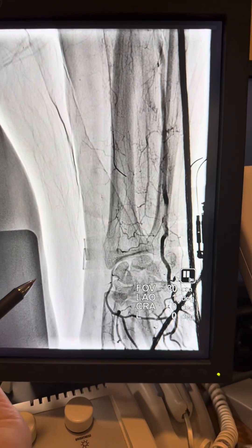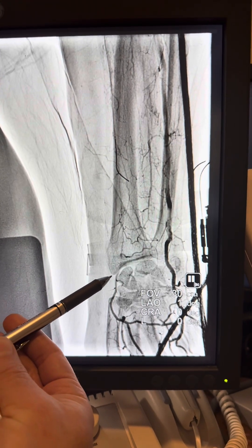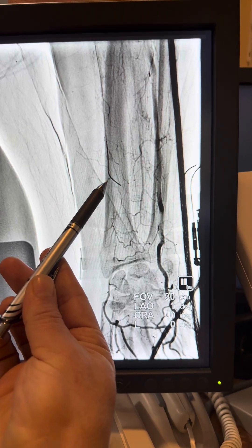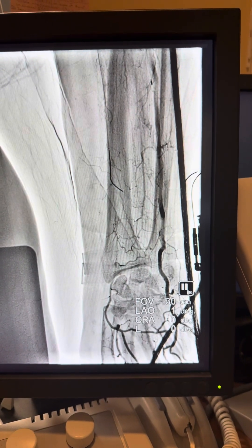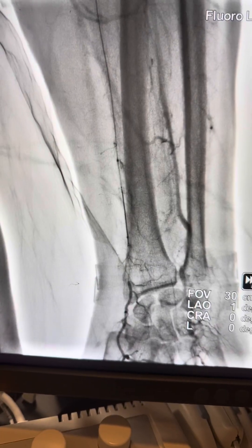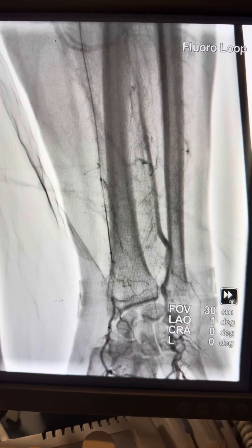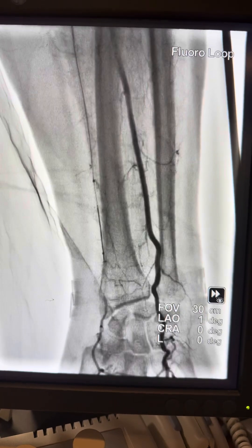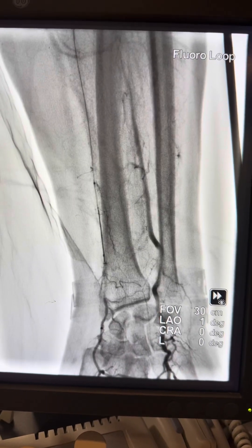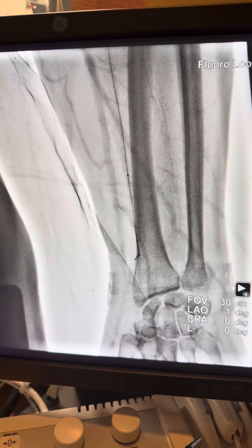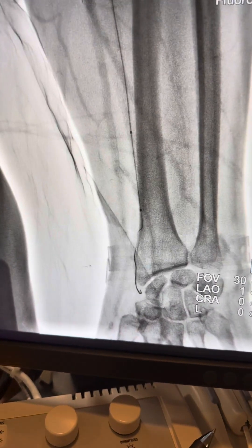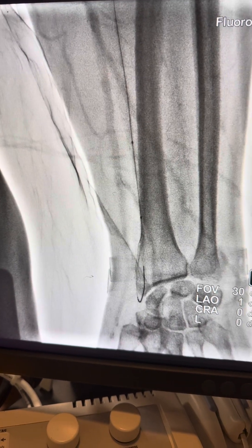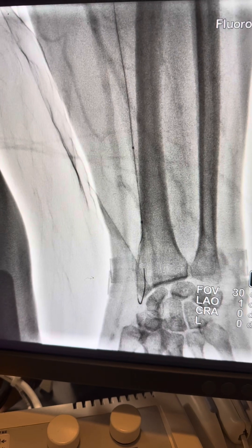With prolonged injection, you can see the collaterals and flow distally — at this point we can see the distal target. The wire still had not reached the true lumen. Here I'm advancing the wire, straightening the tip with the 2.0 balloon without inflation, just to support it.